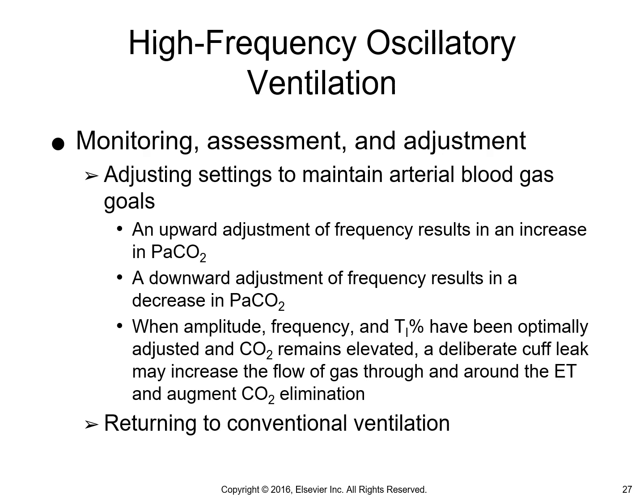One of the things that they suggested was manually ventilate your patient with the ambu bag, the old-fashioned way, at 50% and about 10 of PEEP, and kind of see where their SATs sit. So if they're able to maintain their saturation while they're taken off the oscillator by bagging them at 50% at 10 of PEEP, then maybe it's worth a trial of putting them back on conventional ventilation.